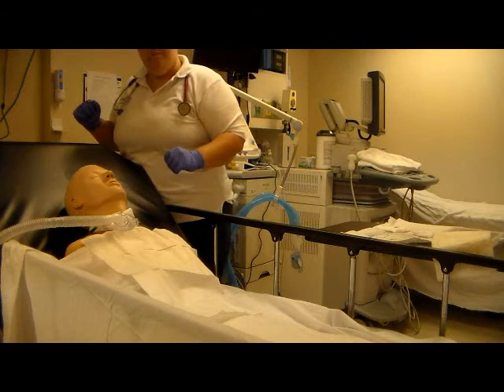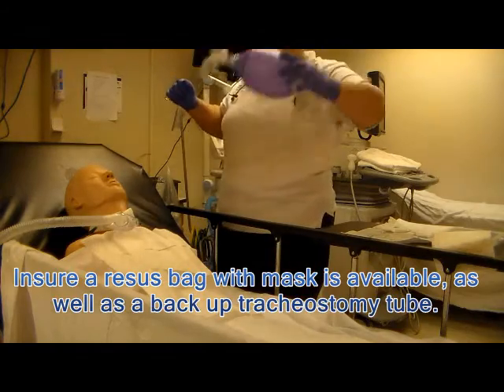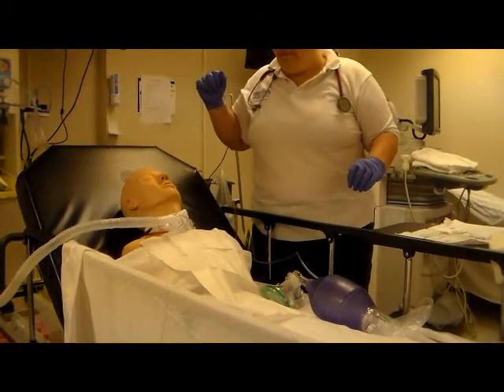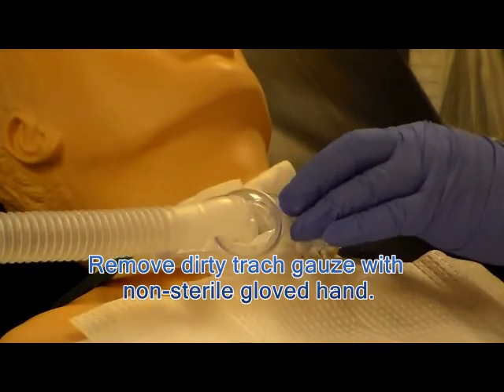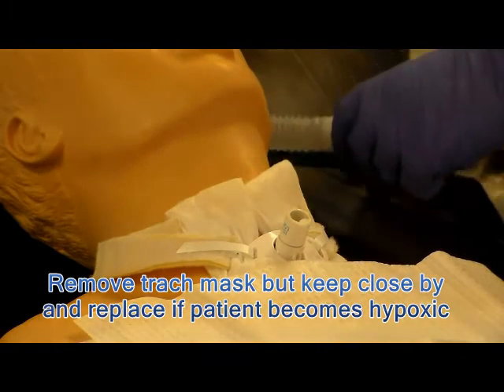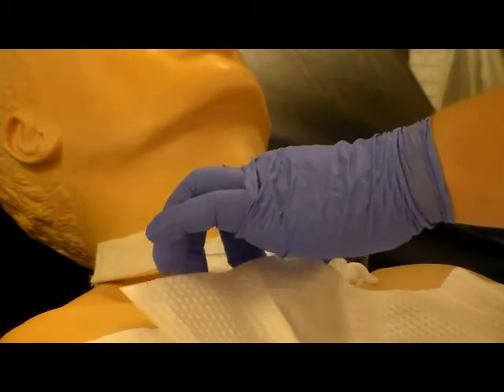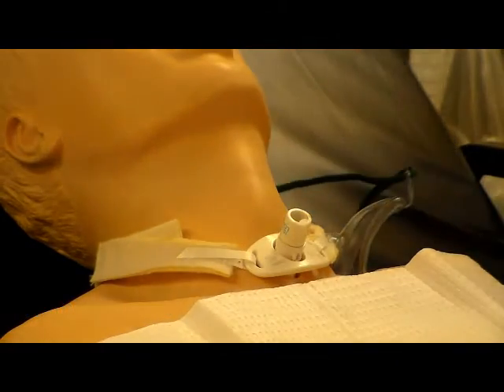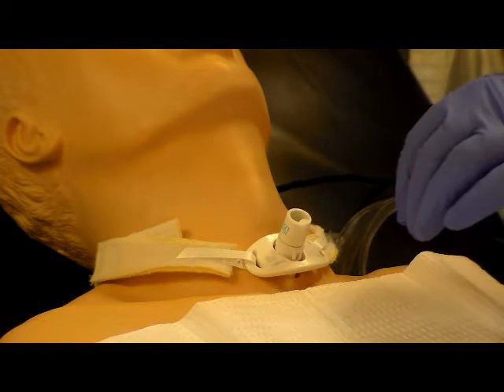Now you are going to remove the dressings. Also make sure you have a resuscitation bag and mask in the event that something goes wrong and you need to do resuscitation bagging. Now removing the trach — you are going to take the oxygen trach mask off, then slowly and carefully remove the trach gauze. It will slip out pulling downward, noticing that the slot is going upward. At this point you are using your dirty hand, and now we are going to begin the cleaning of the trach.